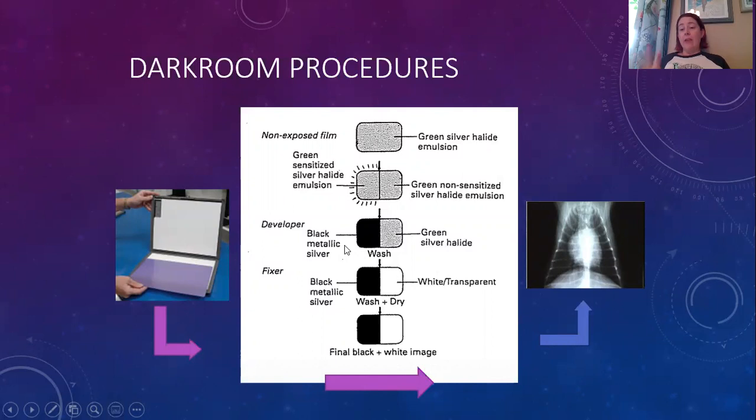So as you can see on that image on the right-hand side, those lungs have had a full exposure of radiation, and then the tissues and fascia has had various levels of exposure going through it based on the density of our patient. The bone blocks a lot of that radiation, but the tissue, it will pass through, and especially the lungs, which are filled with air, those will show up as black on our X-ray.